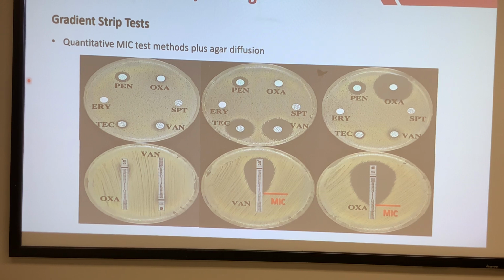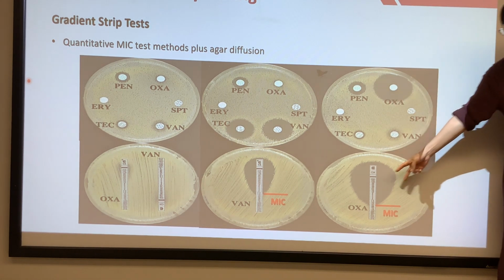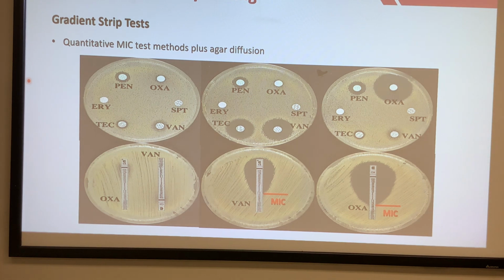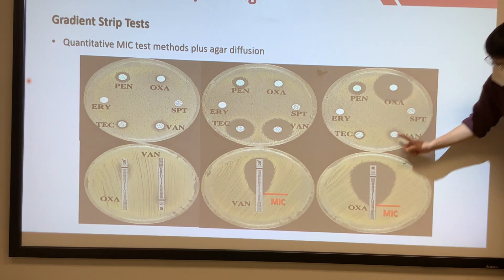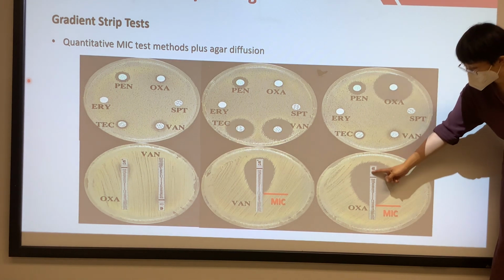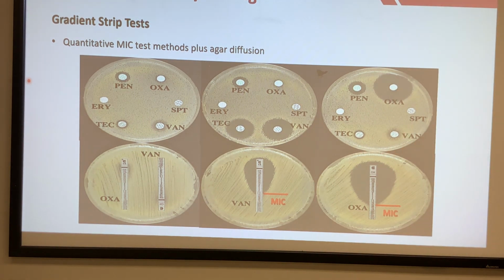It's going to prolong class. Okay, so one last thing for this part is just to introduce other susceptibility testing. The gradient strip test is one that's kind of in debate. Okay, I'll tell you, it's actually very efficient. It's a combination of the disk diffusion and MIC. So it's going to give you a number. When you apply it, you apply it just like the little round disk, but it's going to be a strip, right? And the strip is going to produce an elliptical zone of inhibition.